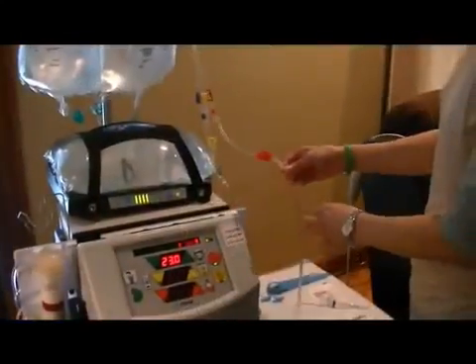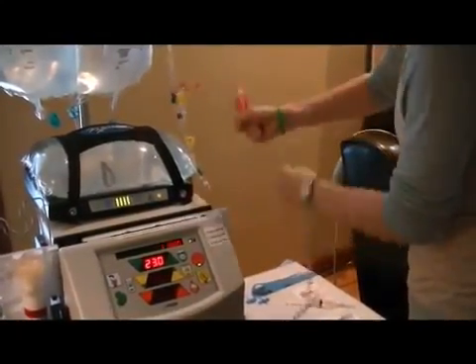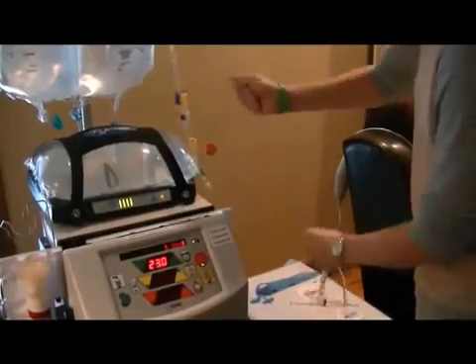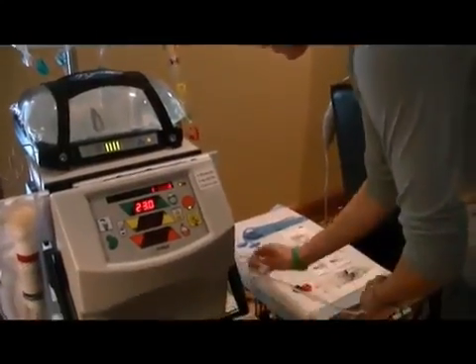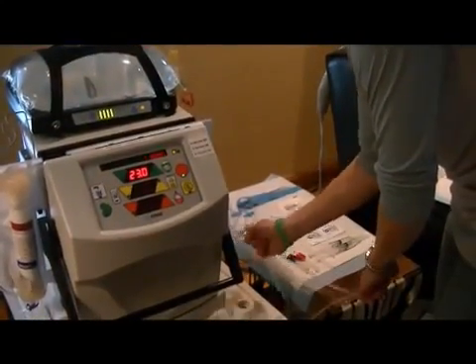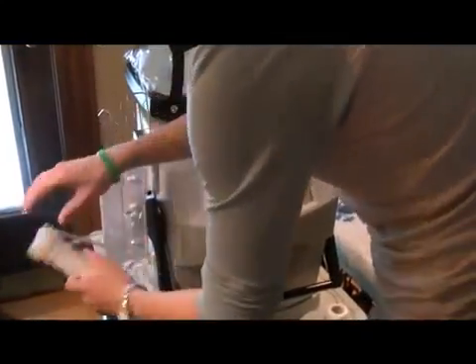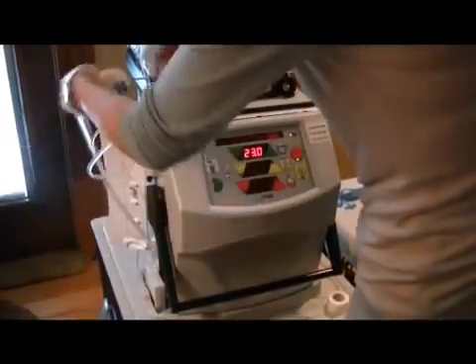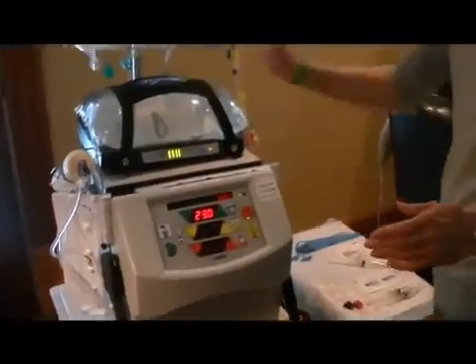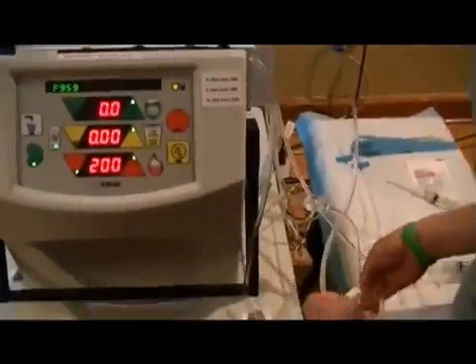The next step we do is called snap and tap, and you have to do it to get all of the air out of the lines. So you go down each line and you do the red and then the cartridge and then the blue, and you go all the way down to get all the air out, and you tap this little guy here to get the air out of it. Then you come over to the cartridge here, the filter, and you have to hit it and get all the air out of it. And you go through and do all the lines in the cartridge twice to make sure you've got all the air out. Then once you've done all the snap and tap, you press stop, and then you have to drain.